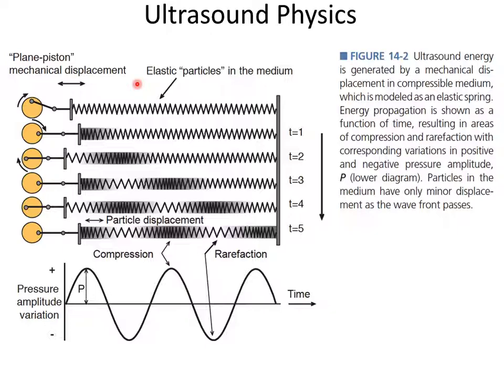So essentially what we're going to use is this physical phenomenon to do echolocation. And we'll use the echolocation to create the picture of interfaces in our object.